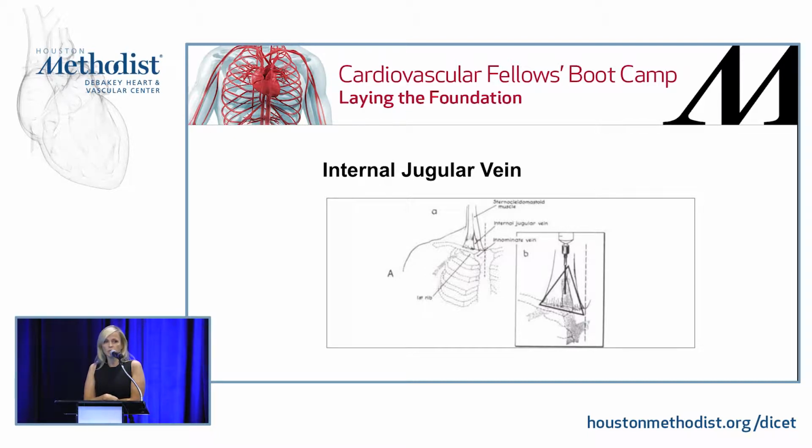So when you look at it under ultrasound, you'll see that little maneuver of heading towards the ipsilateral nipple really allows you not to access the carotid artery inadvertently, because the artery sits deep to it just at that level. And so with the needle at a 45-degree angle, ipsilateral nipple, this is the best location to access your jugular vein.